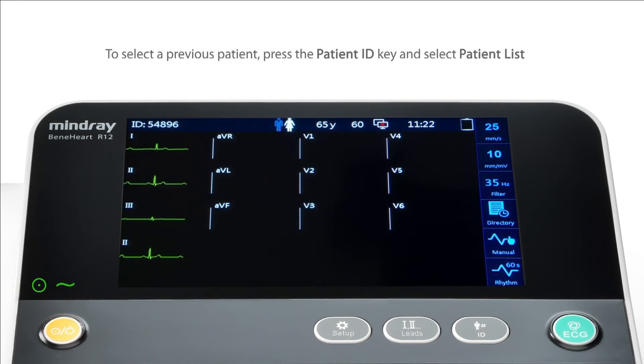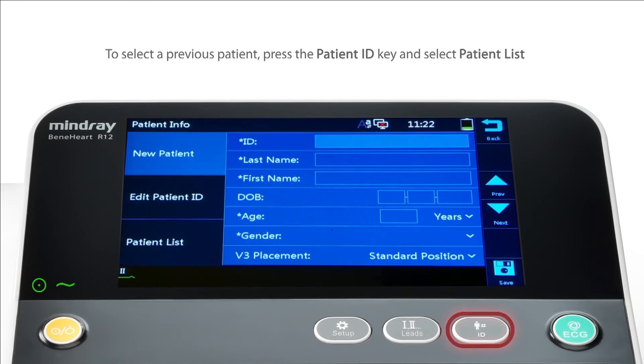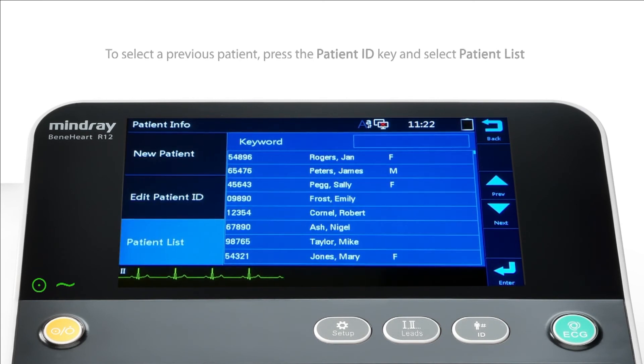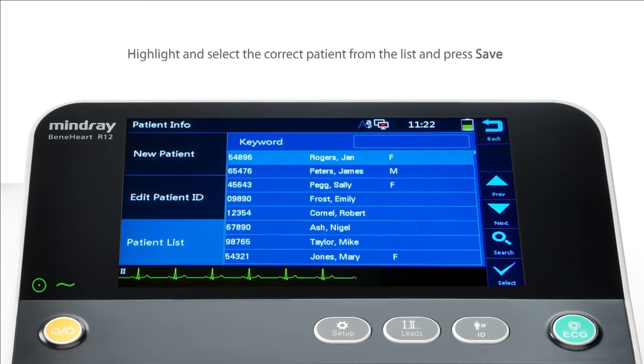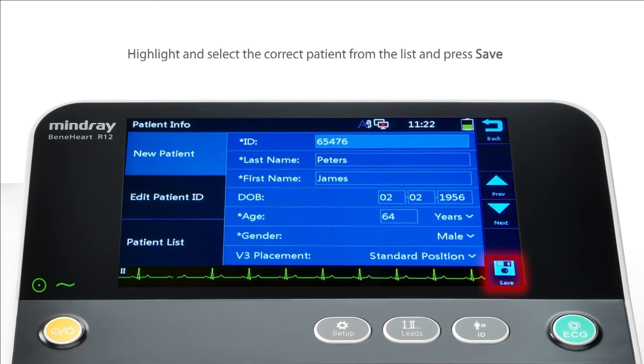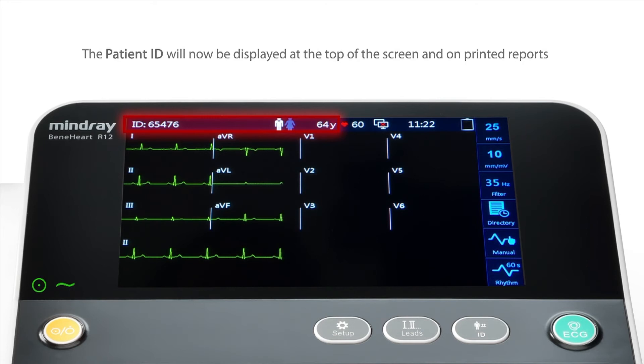You may wish to select a previous patient instead. To do this, press the Patient ID key and select Patient List. Highlight and select the correct patient from the list and press Save. You will now see the Patient ID at the top of the screen and on printed reports.